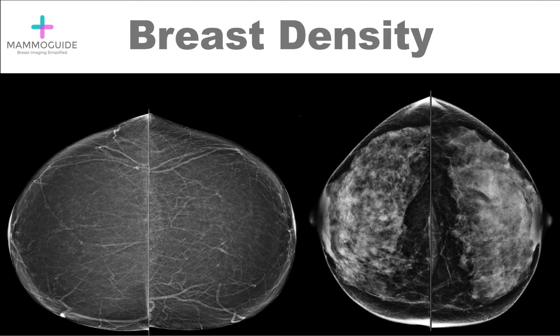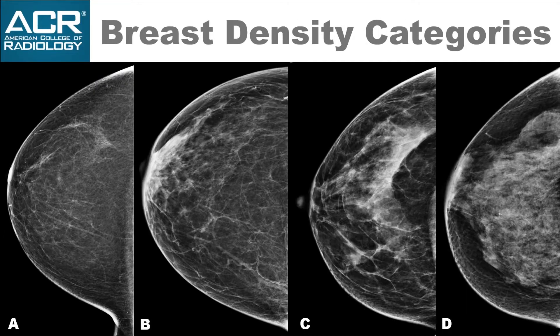You can see the great disparity in these two mammograms. The American College of Radiology BIRAD system has divided breast density into four main categories, A through D, and you can see the gradual increase in density among these examples.